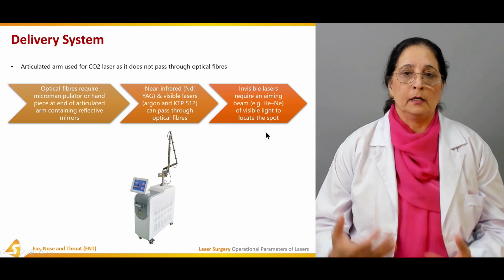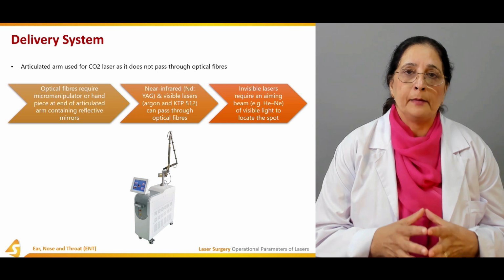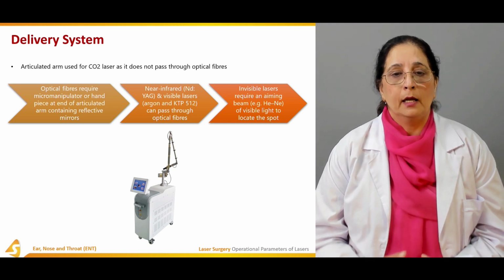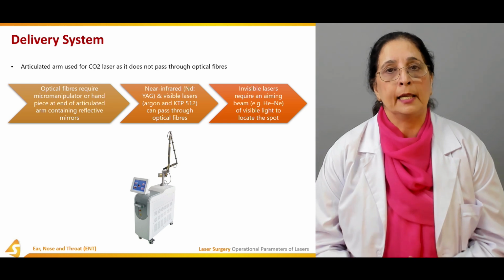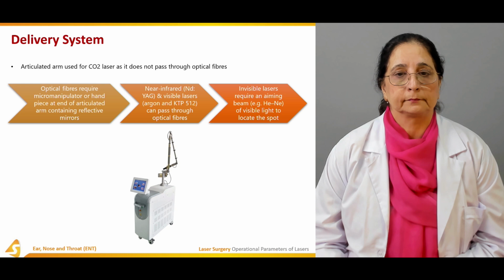So these are the different delivery systems. Some lasers can pass through optical fibers, some require articulated arms with reflective mirrors because they cannot pass through the optical fibers.